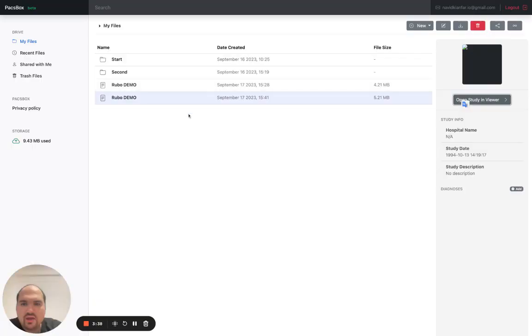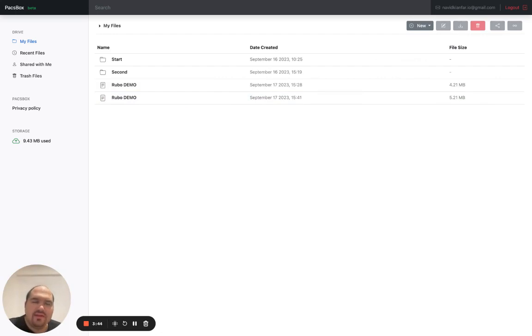So the next stage in developing this product is going to be adding more features. The fact that it's a cloud-based solution allows us to do so much. When it comes to adding AI modules, which we're expecting more and more of to show up every day, we can add these modules to this entire solution. It's very easy. It's on a plug-in basis. This solution can plug into any imaging system that's currently in place to load up all the existing images. And because it's on the cloud, it reduces the need for local database management and having a large archive of different pictures. Just think about it the way you think about any cloud solution. The hospital doesn't have to care about that stuff anymore.